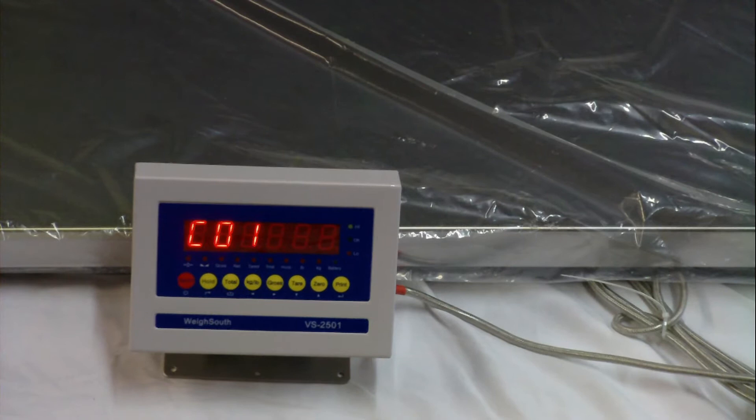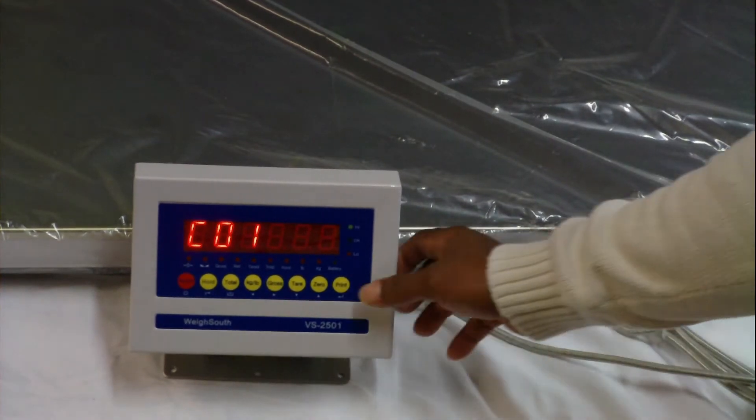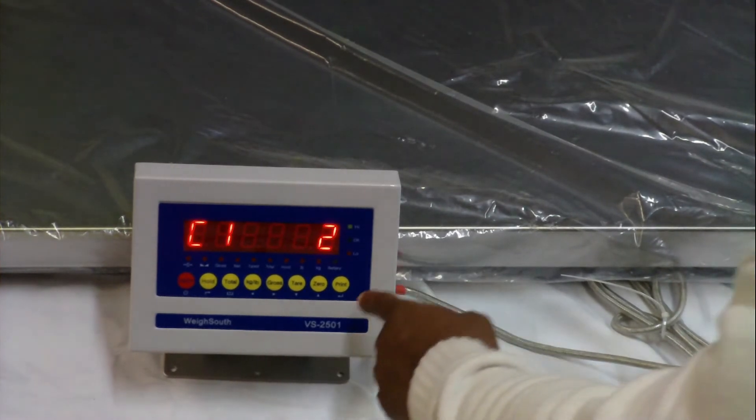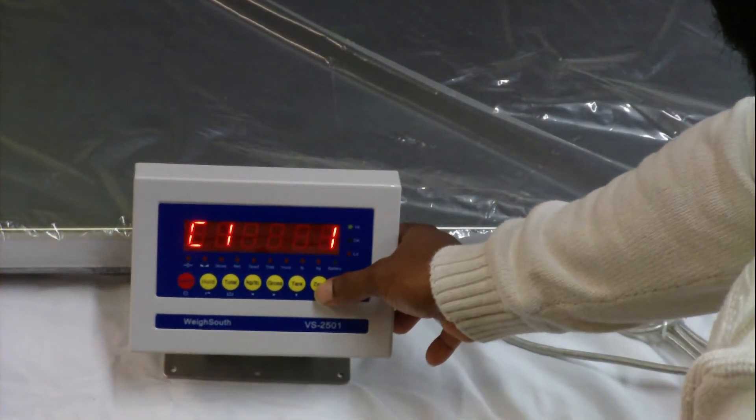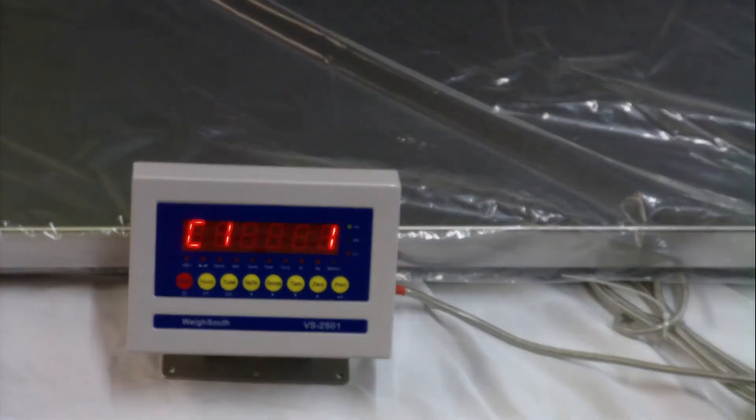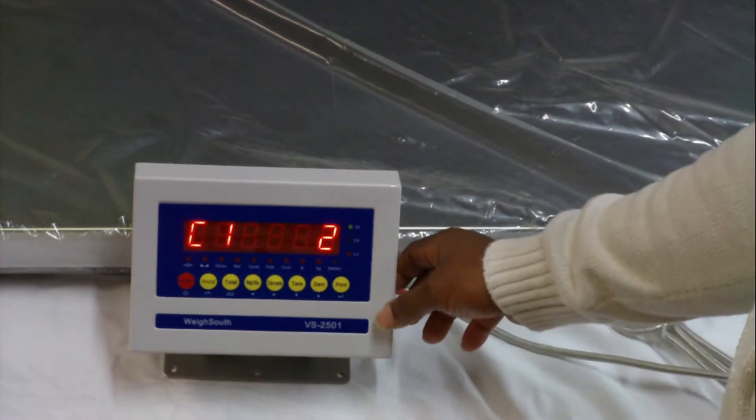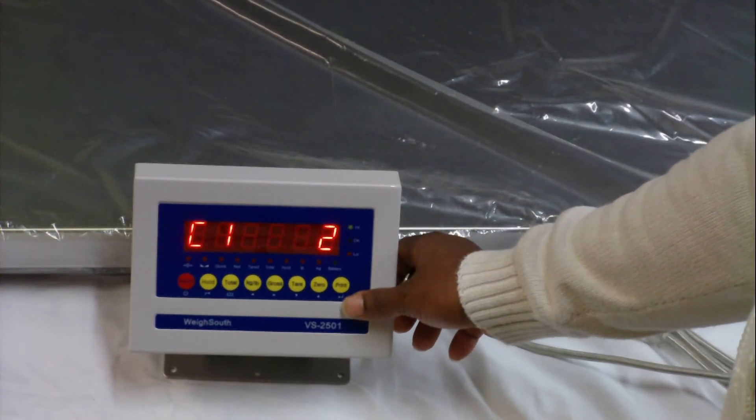To enter the C function, press the print key. You now see the display change to show C1 function submenu of 2. You can change the C submenu by pressing the zero key. When the appropriate C submenu is selected, exit the C submenu and proceed to the next function by pressing the print key.